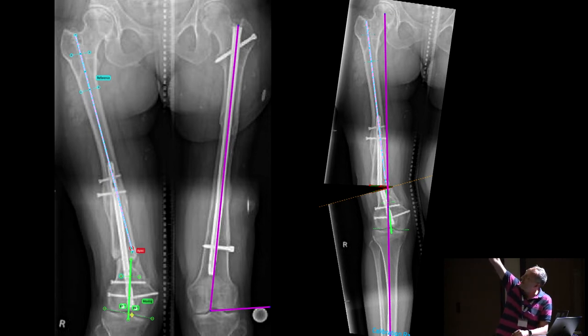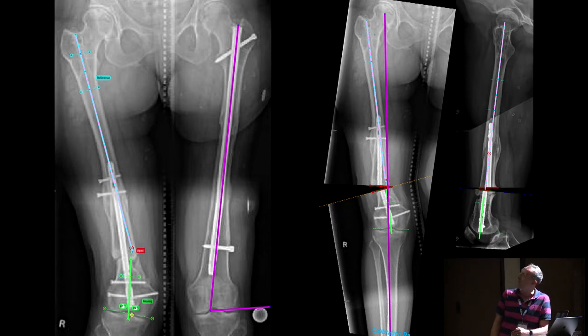The pink line which I've added, which you can see here, is actually a mechanical axis. It's just cut the bottom of her foot off on the screen that I grabbed it from. I didn't have a big enough screen on my laptop to show the whole thing while I captured it. And of course, it's important to remember it's a three-dimensional structure. So think about the effect that this will have in both planes, or actually in three dimensions. So this is where I felt her correction should be, to correct her axis, looking at the deformity as I had defined it.